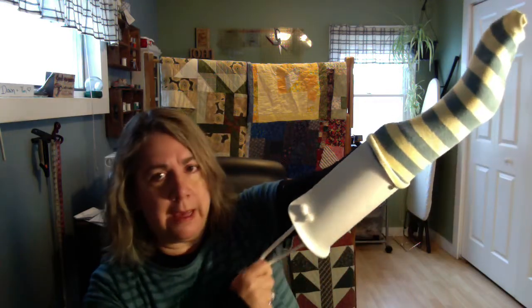I also have what I call the sock putter-onner, which is a long name for a sock aid. This thing is fantastic. You slide the sock on. Let me show you with one of my arm. We'll get to this hack in a minute. But if, let's say that was a sock, you just slide it on. This would be the toe, so it would be closed, right? You put it on the floor, you slide your foot in it, and you use your hands and you slide it up, and look at that. Isn't that amazing? I love this thing.